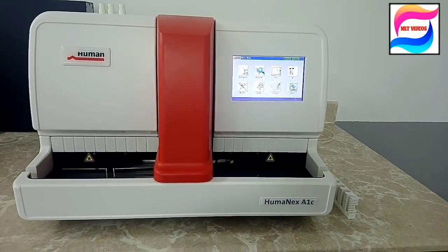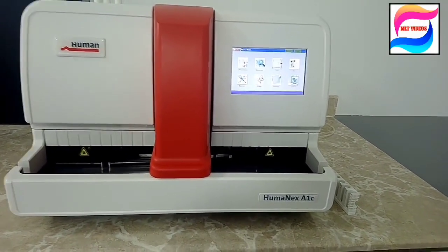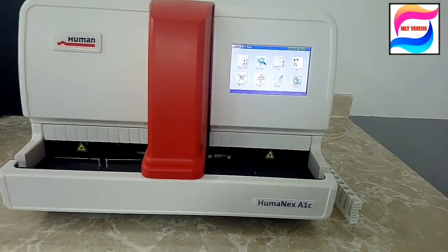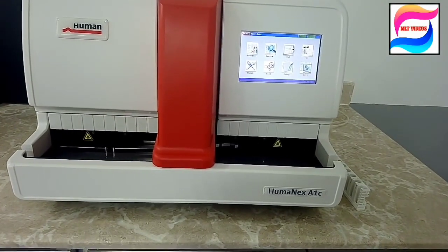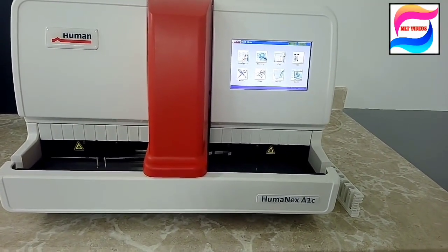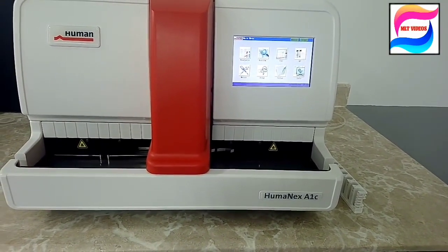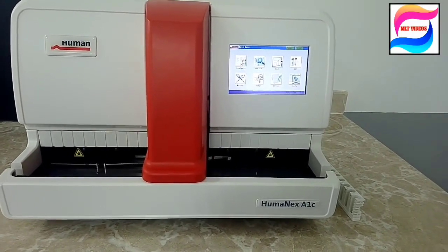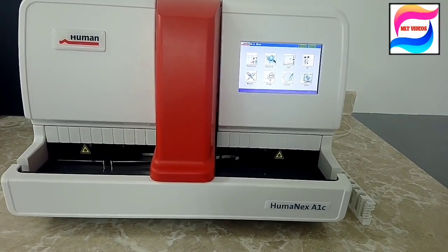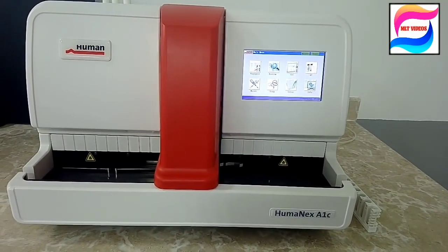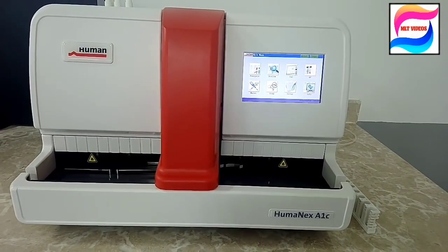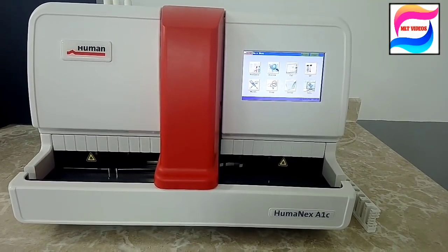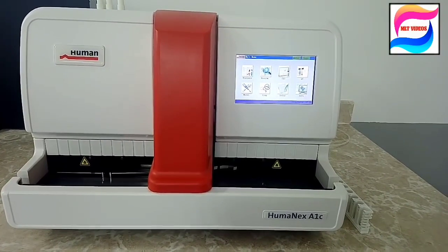Welcome back friends. Today in this video I will give you information about HumaNex A1C analyzer. As from the name you can understand that this machine is used for the test HbA1c, also called glycated hemoglobin, that is used to check for sugar diabetes. Not only to confirm diabetes, but for prediabetes, for pregnant ladies, for most of the time we need this test HbA1c.